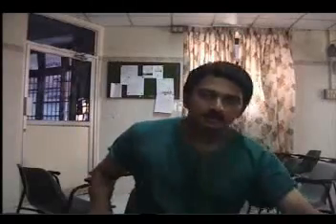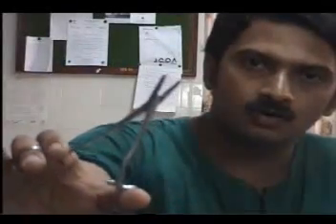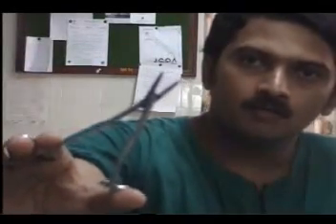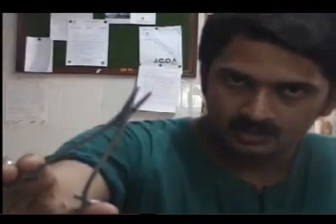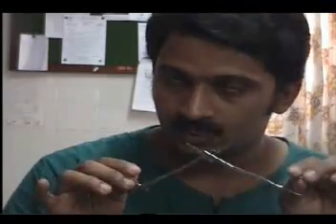Let us start with the most simple of these things. This is the ordinary needle holder. One way to differentiate a needle holder from another instrument like an artery forceps is to look at the insides. If you look at the insides of the needle holder, you will find that there are diamond-shaped serrations — that is, criss-cross. If you find a criss-cross serration inside a forceps shaped like this, most probably it will be a needle holder.